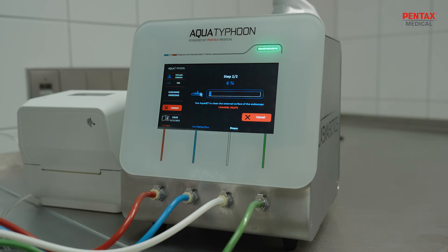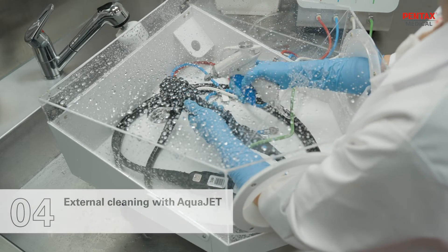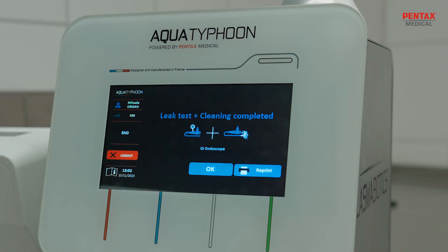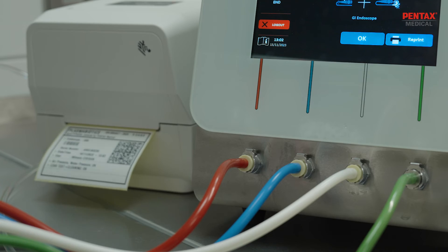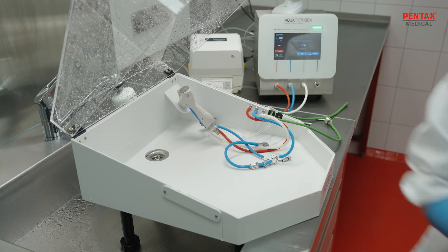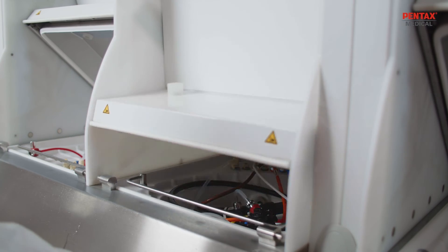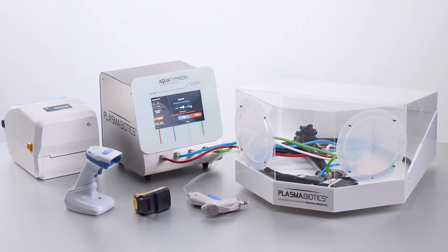Once the automated step is done, the operator reuses Aqua Jet to clean the external surface of the endoscope. Embedded automatic validation with integrated alarms ensures that the leak test and cleaning cycle are properly completed. Aqua Typhoon revolutionizes endoscope reprocessing by providing an advanced alternative solution to manual pre-cleaning.